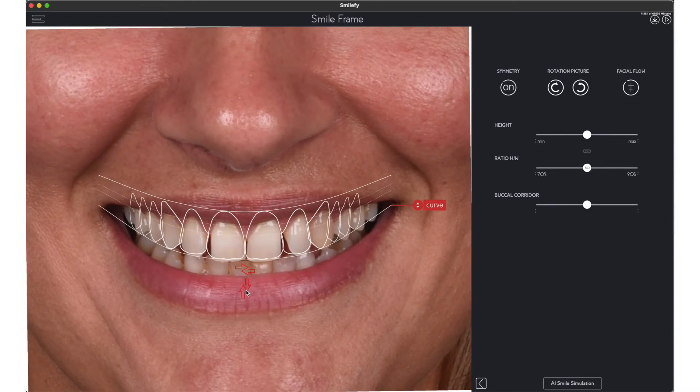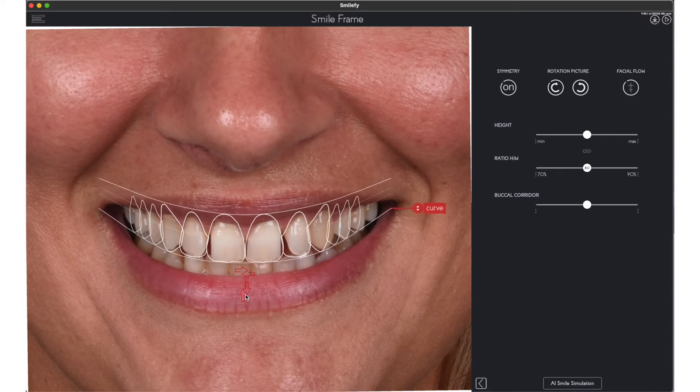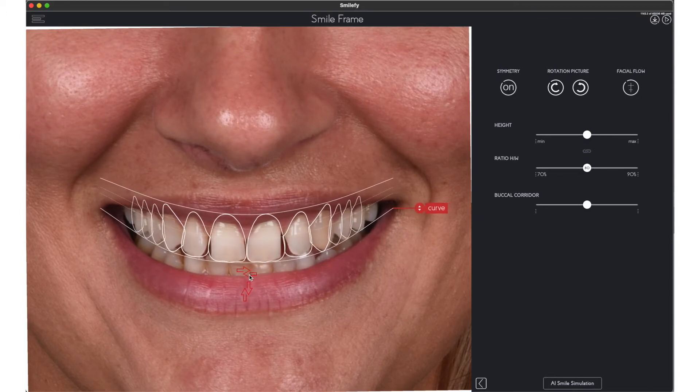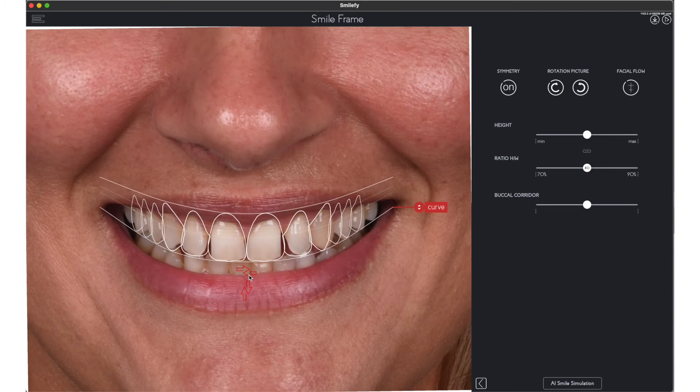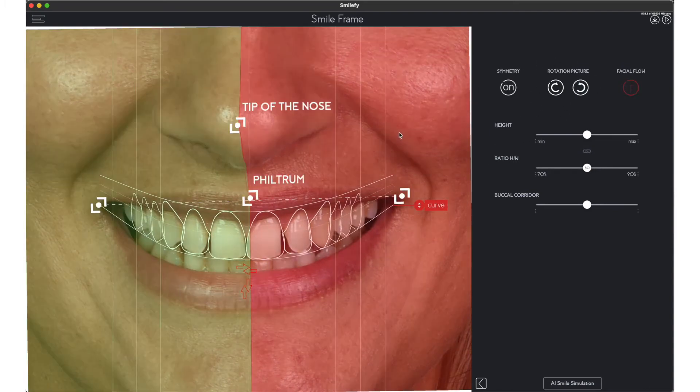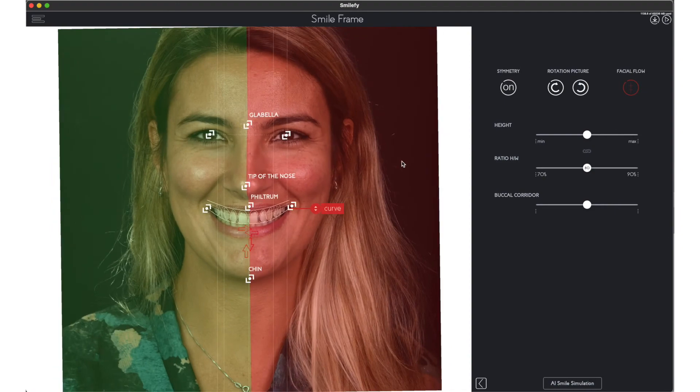Using the arrows you can readjust the position. On the right side you have the toolbar. You can turn on the facial flow analysis and visualize the facial characteristics.